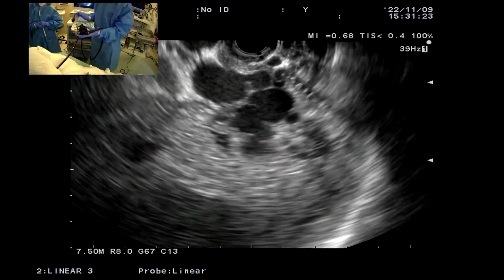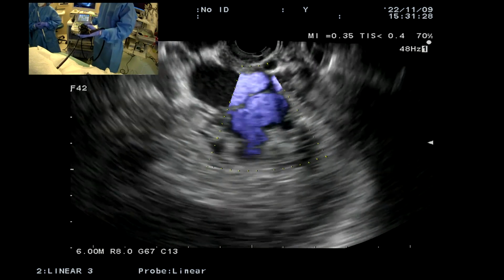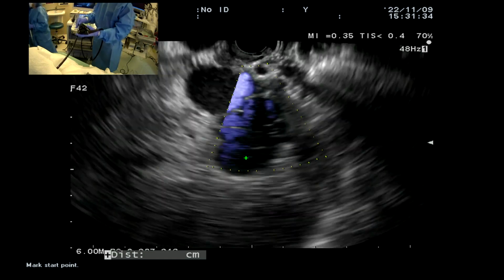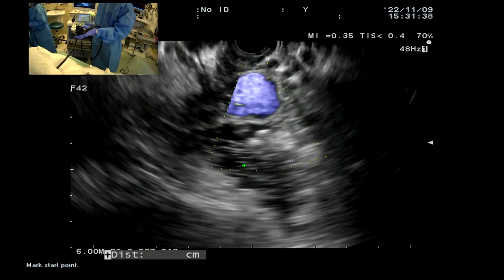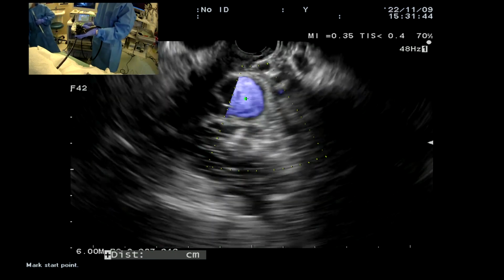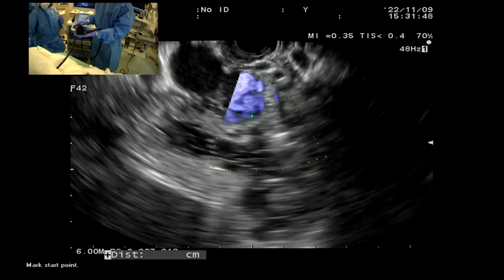So I'll just point that out so you can see it well. Let's put the Doppler on, in fact. So you can see here, these are the fundic varices. And the fundus is down here. It was filled with water. There's the water. You see it in the fundus, right? So we're going distal esophagus, transesophageal now from the back into this large fundic varix.